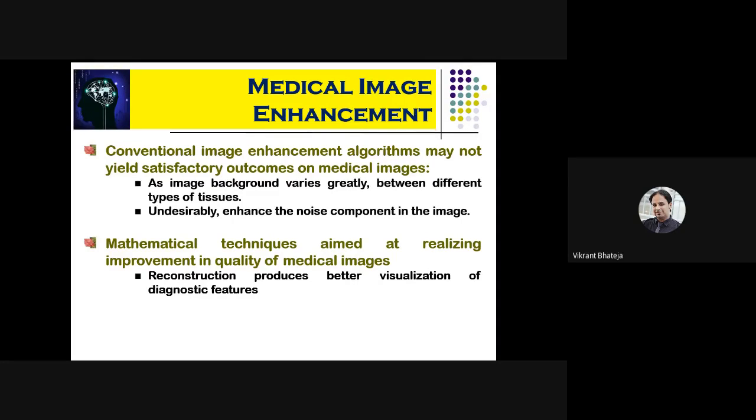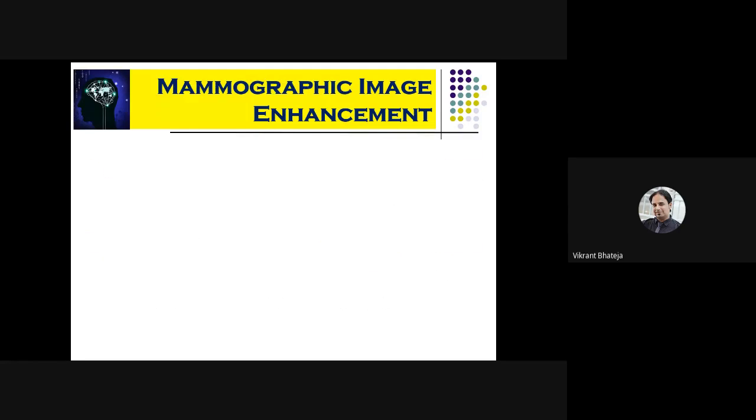So you want techniques for medical image enhancement where contrast can be improved in a balanced way, and there is no undesirable enhancement of the noise during that process. That means when enhancement is being done for medical images, one has to ensure that in order to amplify the contrast, one does not end up amplifying the noise component.